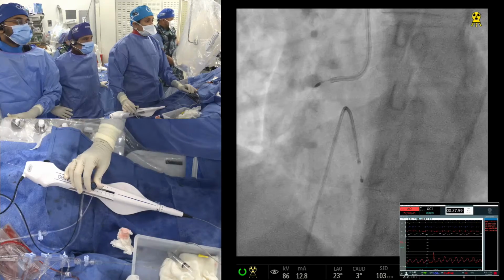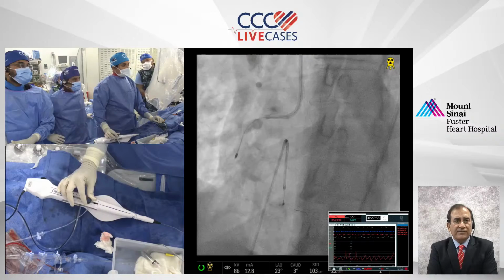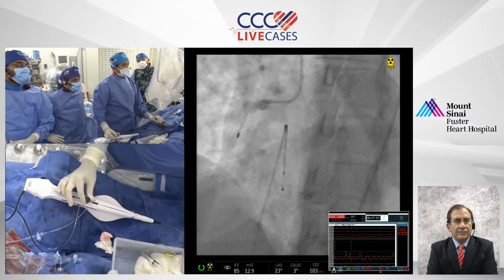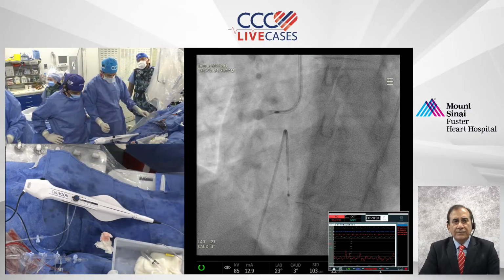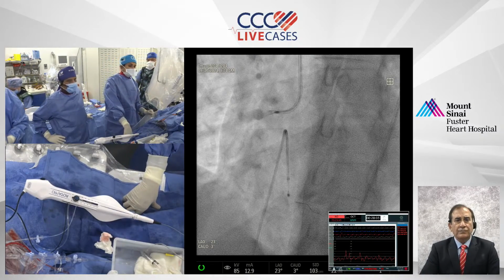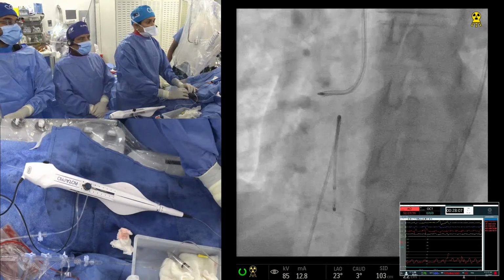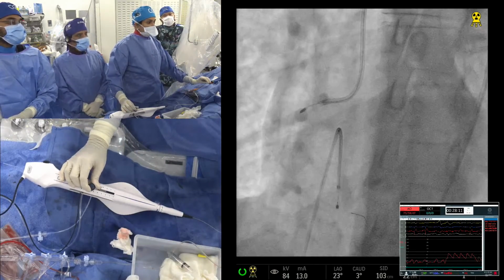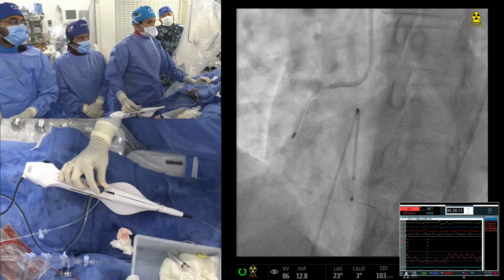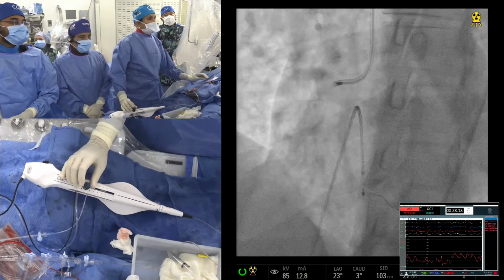I mean, more and more people are moving away from using temporary pacemakers. Yeah. And just staying with aminophylline or... That is correct. Aminophylline atropine combo, which is okay. But particularly if you are going through the femoral, I would say the emphasis is more so. If you are going radial, definitely will not put a femoral pacemaker. But yes, aminophylline and atropine work quite well.